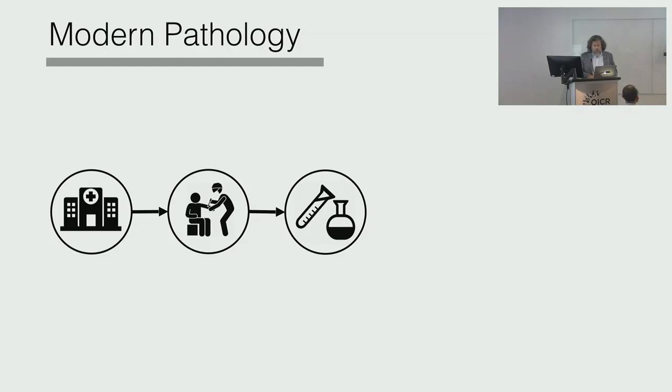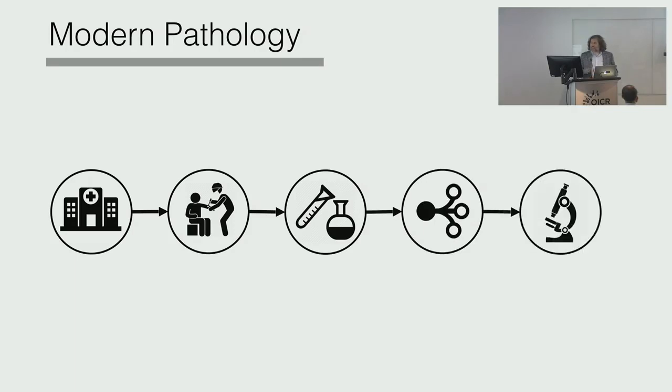After it gets processed, it goes to some sort of distribution channel, and that distribution brings the tissue sample to the pathologist, and the pathologist is the last instance. What we do in radiology is basically an educated guess. Nobody gets treated based on what is suspicious in an X-ray. But what the pathologist says goes. That's the end of the line. That's the definitive diagnosis, and that's the reason that pathology is so important.